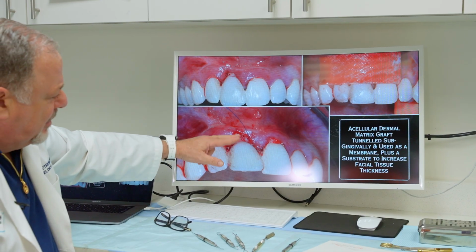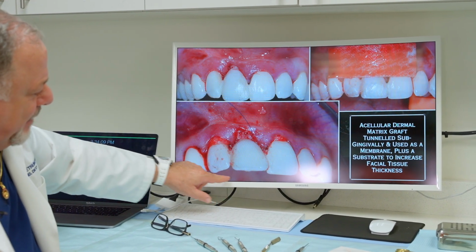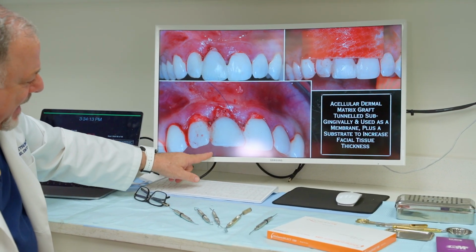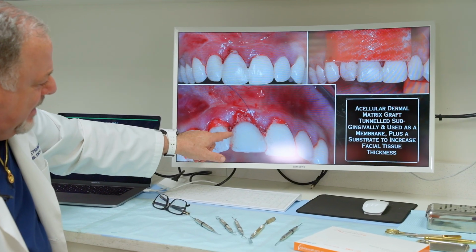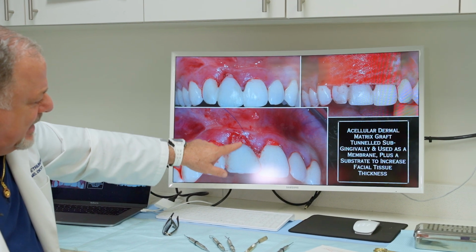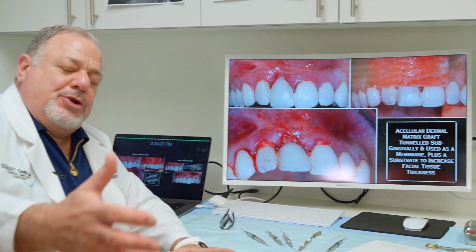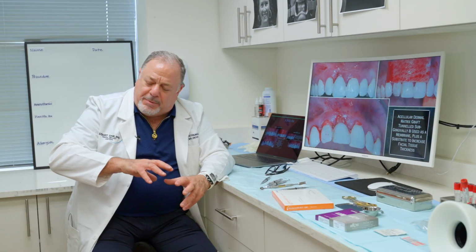Now I've had the dermis underneath here just held out, and I'm placing graft complex into the buccal plate, and then the polypropylene is coming from the palatal, and I'm going to pass it around to the back here, come back into the distal palatal, grab the tissue again, bring it back around to here, bring it out here, and then I'm going to secure that off. So I'm going to tie the dermis in. It's going to have a palatal knot where it's secured, because the other tissue will grow over this. It will hide that 6-0 polypropylene suture, and we tie it on the palatal so we can see it.